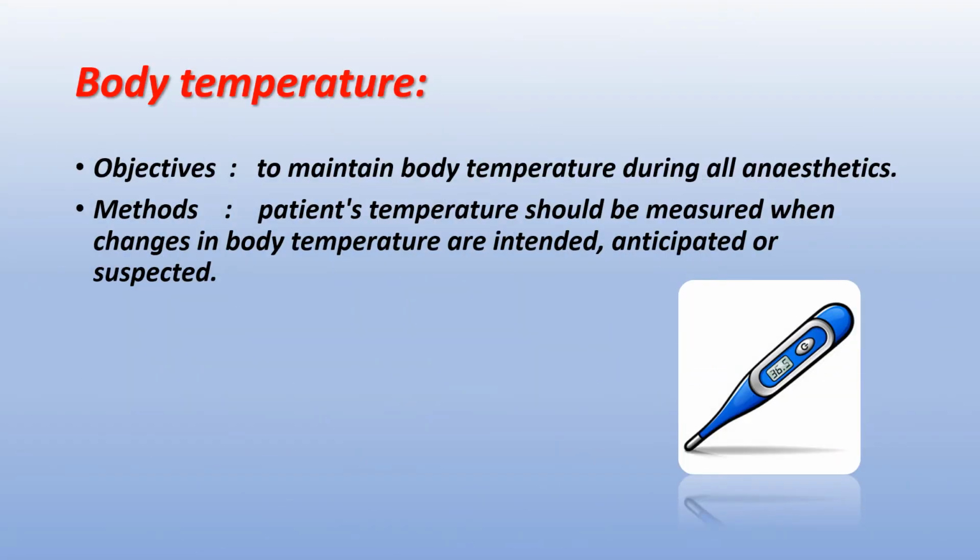Body temperature. The objective is to maintain body temperature during all anesthesia. Methods: patient temperature should be measured when changes in body temperature are intended, anticipated, or suspected.